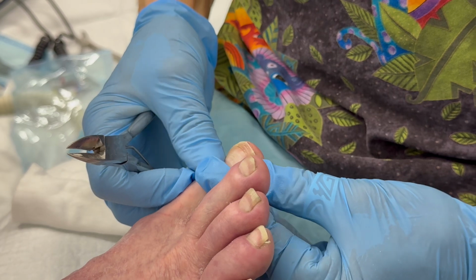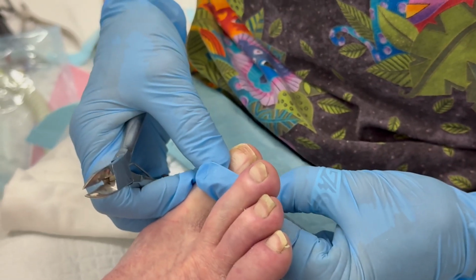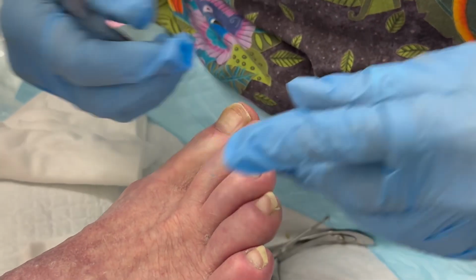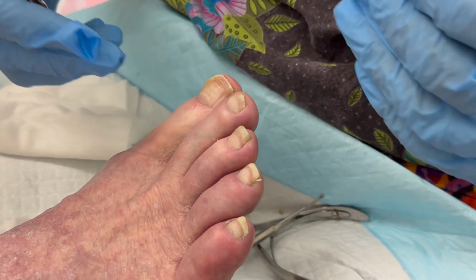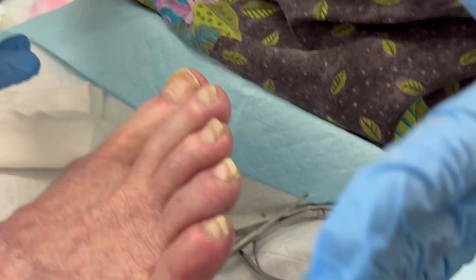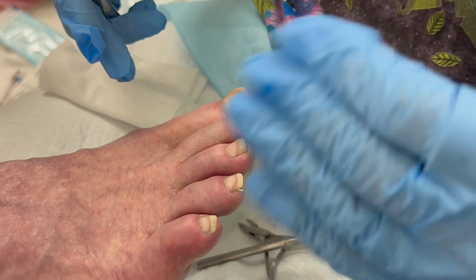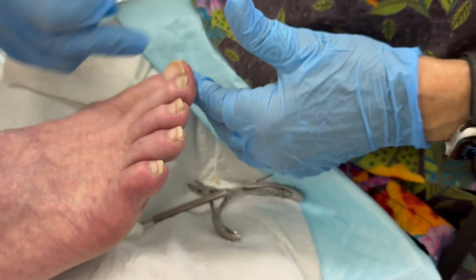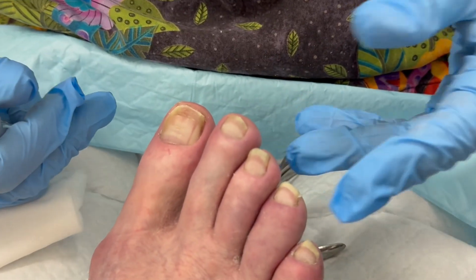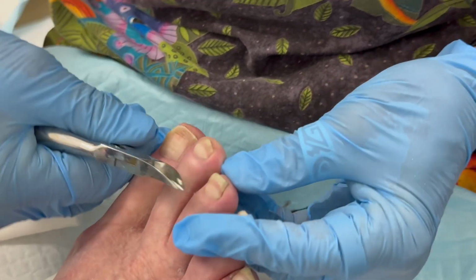And I'm going to, on this side, good? Yeah. Is it a little bit painful? Because I could go down the side on that if you... No, let's not encourage it. Okay. That's good. And I do ask them, because sometimes they say cut the nail straight across. They say cut the nail to the curve. Everybody says a different thing. I say cut the nail the way that nail needs to be cut. One side might be straight across, and the other side, like this, goes way, way down. So it's not rocket science. There is not one way, and you're going to see different things, and you just have to make up your mind. This one's short enough.